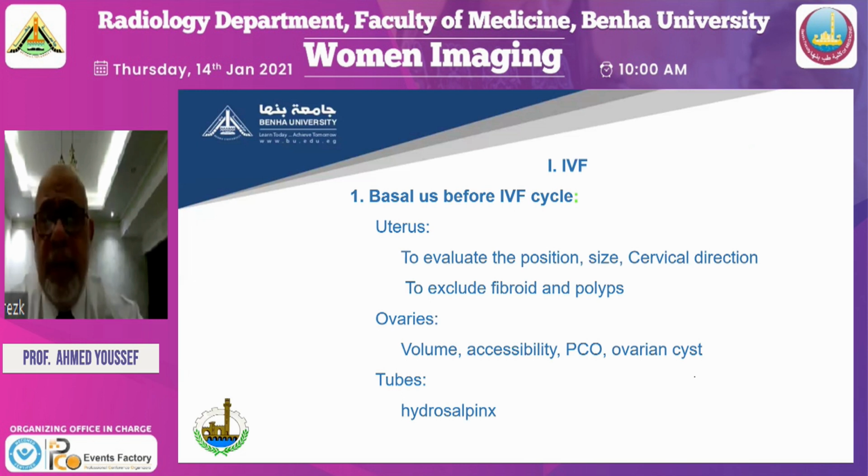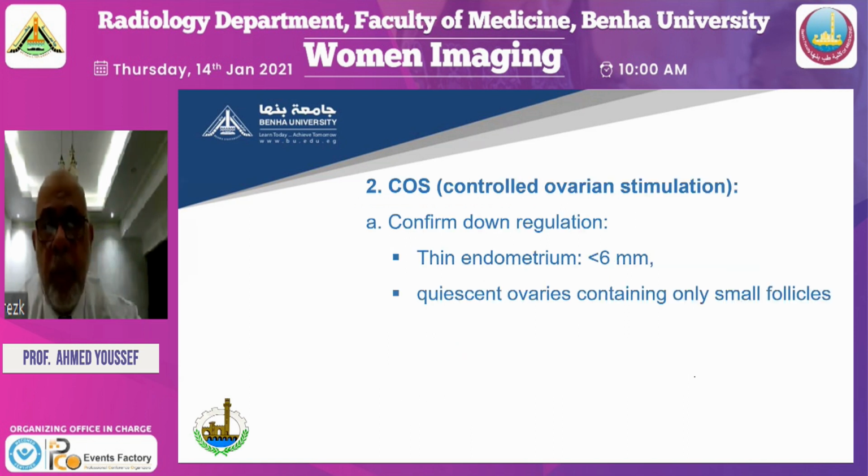Also, the presence of ovarian cyst before the start of the IVF cycle. Diagnosis of hydrosalpinx is essential, and I have to deal with it before the start of the IVF cycle. So ultrasound helped me a lot in diagnosis of this important pathology.